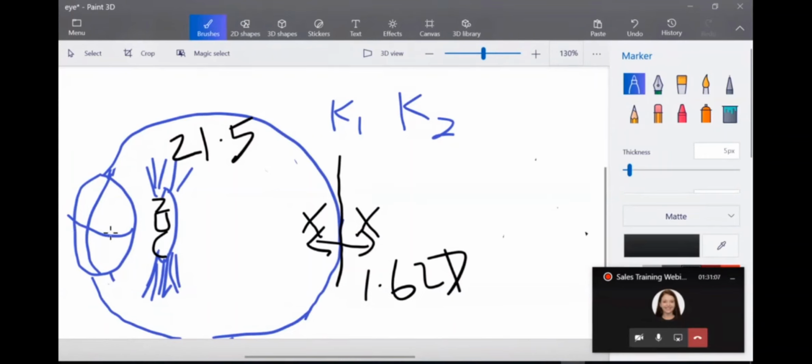So this cornea power, which has more power, plus 21.5 diopters on the lens, has too much power. On the opposite side, where the cornea power is lower, when you add that cornea power to 21.5 diopters, that is too little. So this 21.5 diopters is too little for a certain power of the cornea, and too much for a certain power of the cornea.